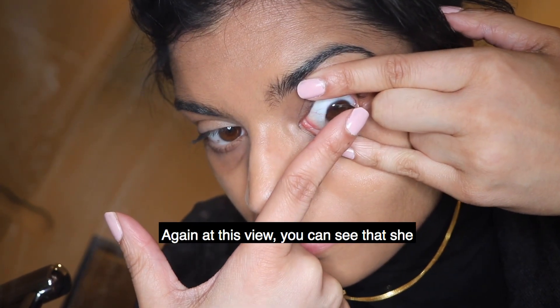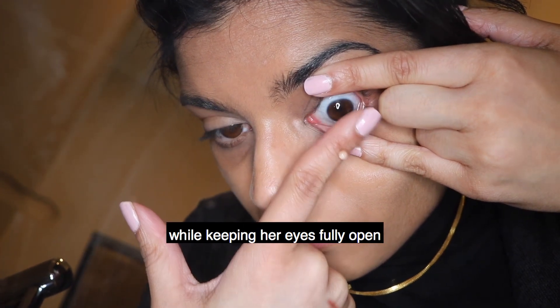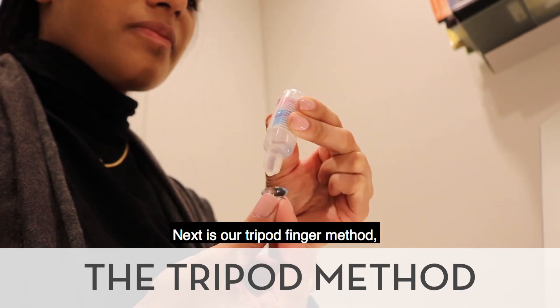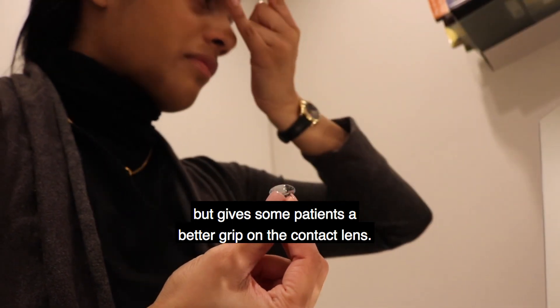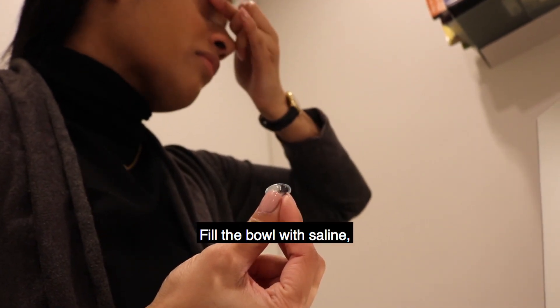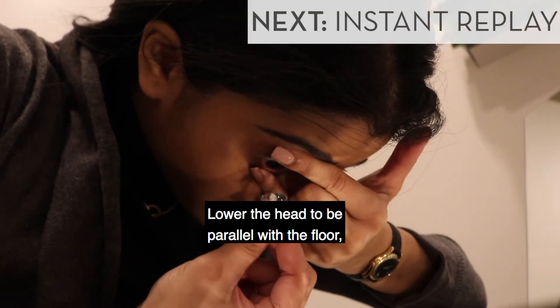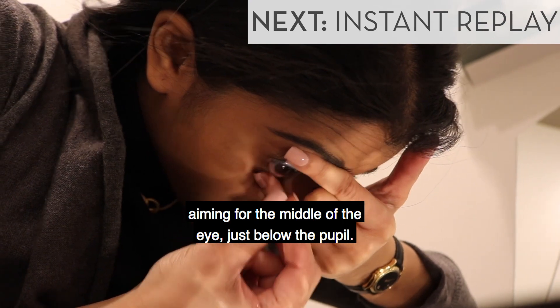You can see that Elisa is putting the contact on the center of the eye while keeping her eyes fully open. Next is our tripod finger method, which is similar to the previous method but gives some patients a better grip on the contact lens. Fill the bowl with saline and use your preferred grip to open the eye. Lower the head to be parallel with the floor and gently insert the lens, aiming for the middle of the eye just below the pupil.